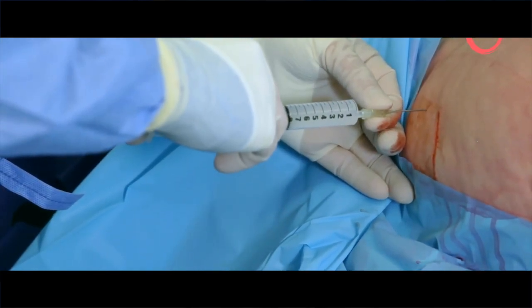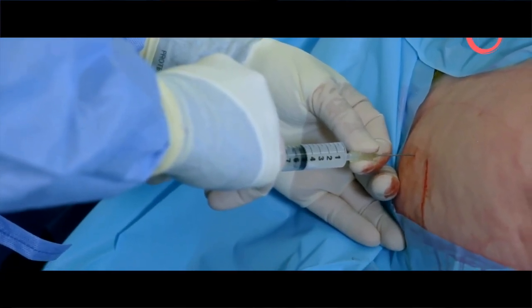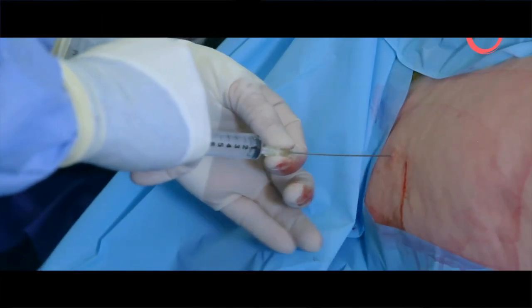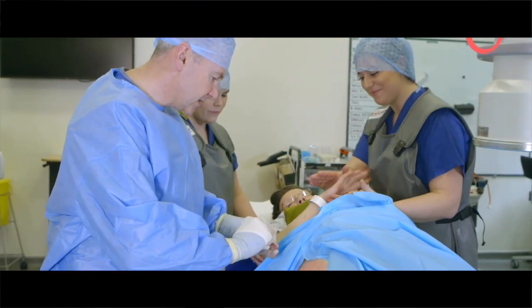Once we've injected the therapeutic substance into the hip, then we simply remove the needle and place on a little dressing. Good, well done. And I'm on my way out, okay? Well done, you did really well. I'm popping a little sticky dressing on there.